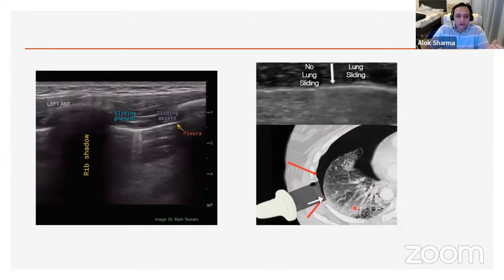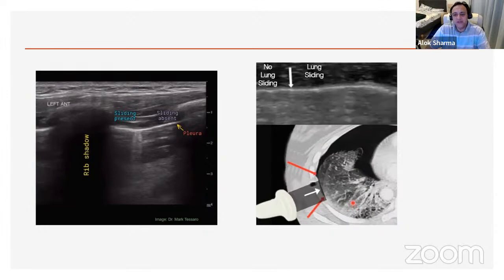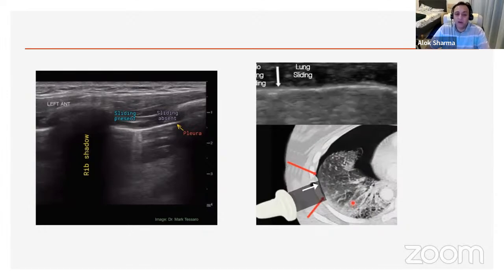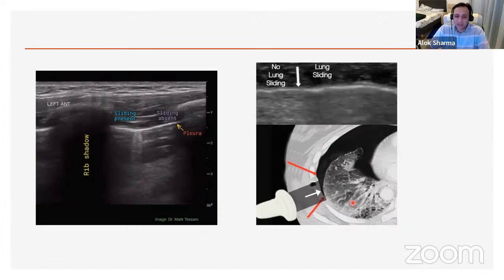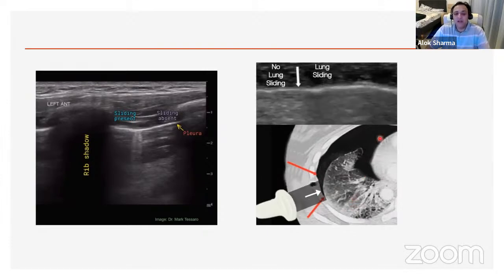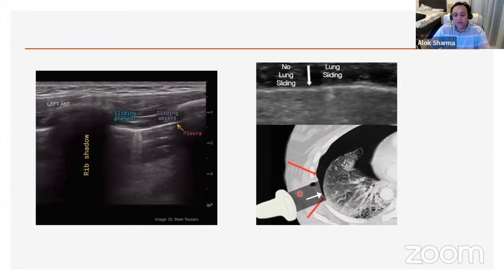When you're doing a lung ultrasound in situations like this, as Nadia will talk to you about when we're using the SAFER or the SAFER-R protocol, please have somebody looking at the baby and keeping an eye on the observations. Please make sure that they're able to interrupt you if they find that the baby actually needs resuscitation or we need clinical management as opposed to you doing your ultrasound. And be aware of the weight of the ultrasound, your hand, all of those things in an extremely small baby and the impact of that.